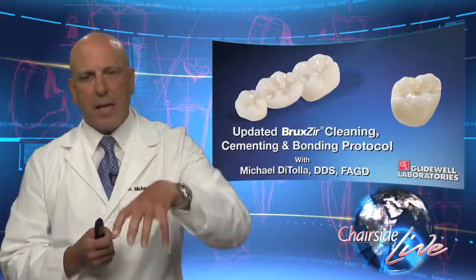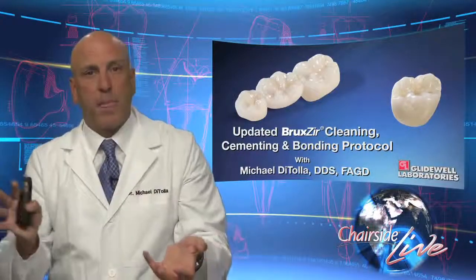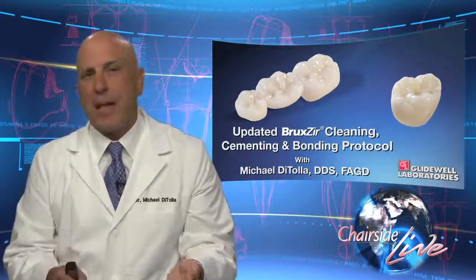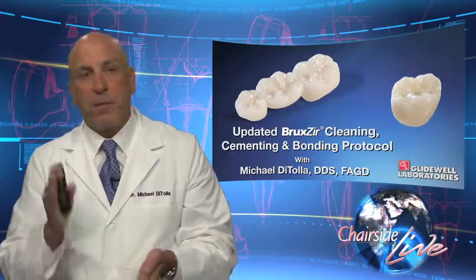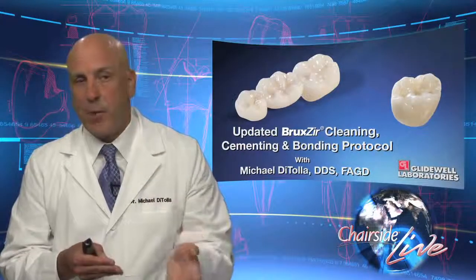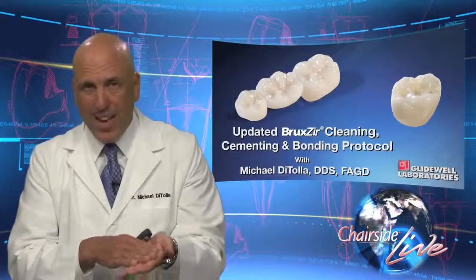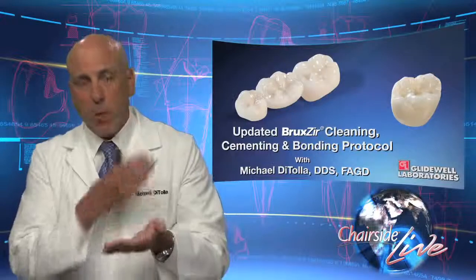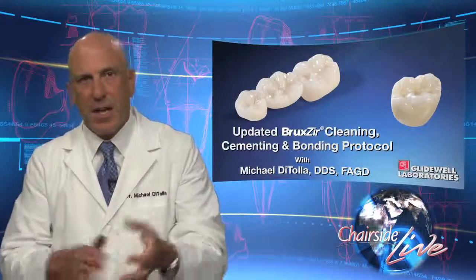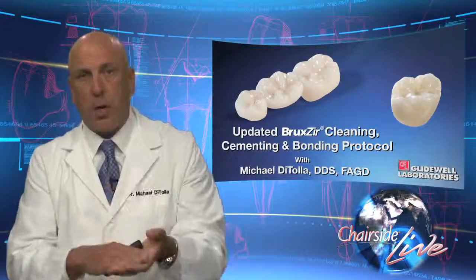When you try a crown in the mouth and get saliva on the inside, then take it out and rinse the BruxZir crown with a water and air syringe, it looks like you got all the saliva out of there. But the phosphate groups in saliva, which is full of phospholipids and some other forms, remain bound to the zirconium oxide on the inside of the crown. So you've rinsed all the saliva out to the best of your knowledge, but what you can't see is that you've actually got phosphate particles still bonded to the zirconia particles.